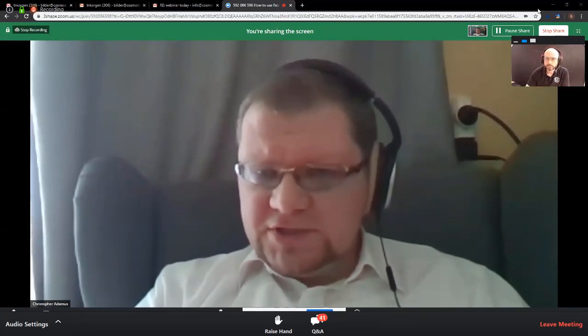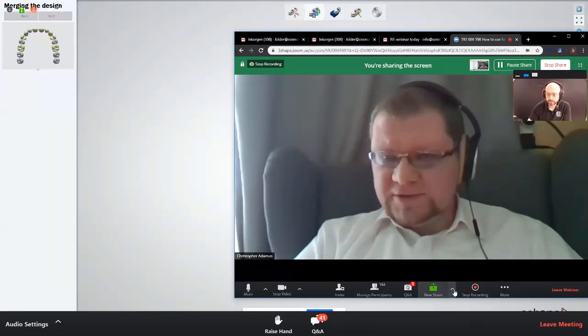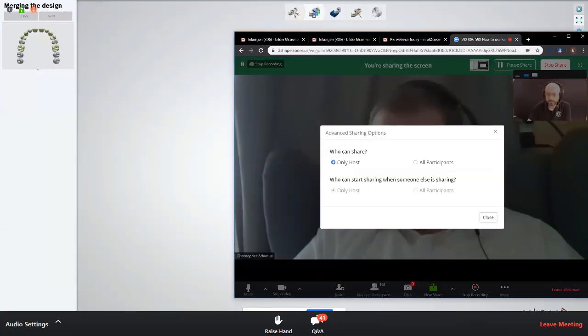There is a question. Let me just read. I haven't seen it yet, but let's take a look. You just said something about a silicone model for a doctor to inject composite. So is it a printed silicone model? Can you do it using Model Builder?